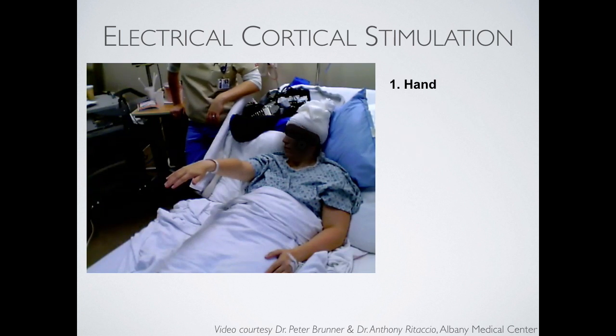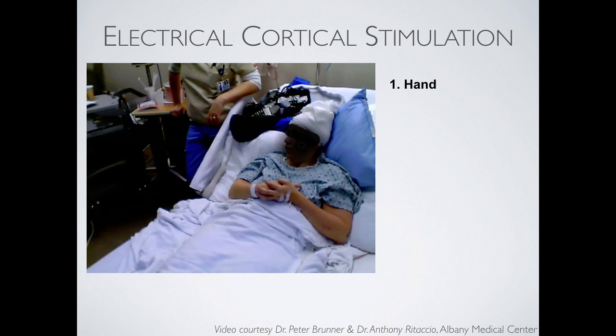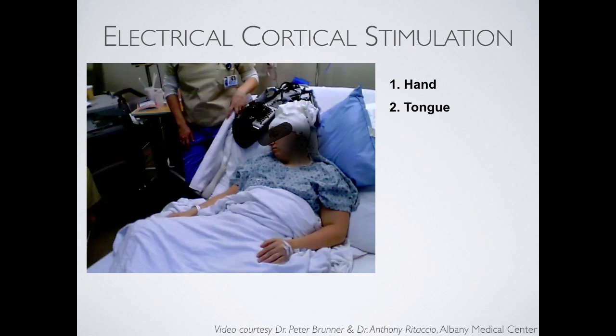This is an example. At 3, it's just going to go first. Relax. Oh, whoa. Yeah. So somewhere around 2, you saw a mild tremulousness. Okay, I didn't like that. No, we're not going to do that anymore. That was hand, ulnar. Stick out your tongue. She's sticking out her tongue. Tongue protraction. And as soon as he stimulates, she can't keep her tongue stuck out anymore. It's back into her mouth. Keep it there, keep it there.